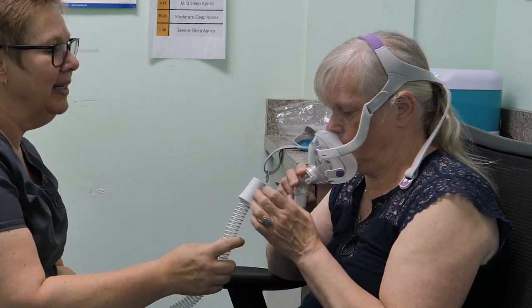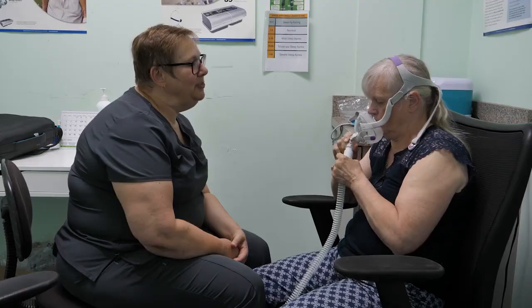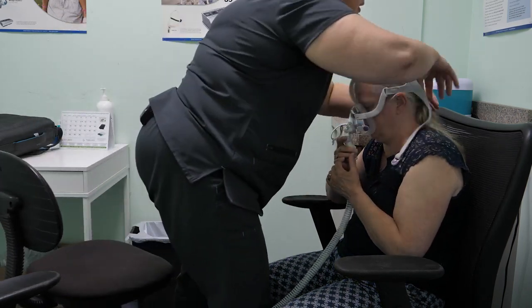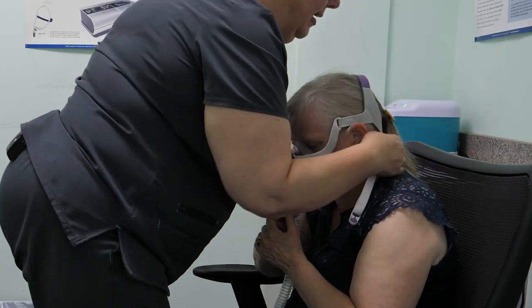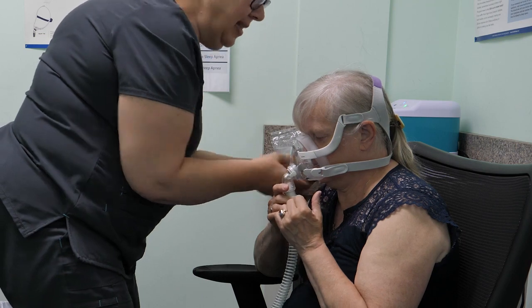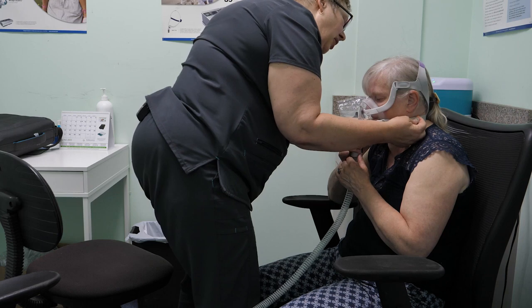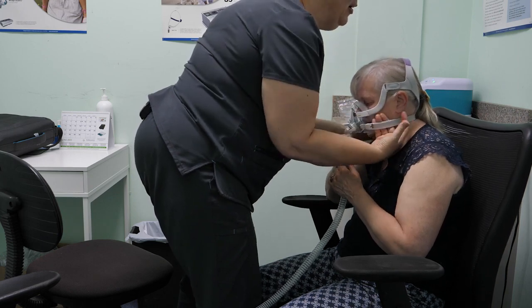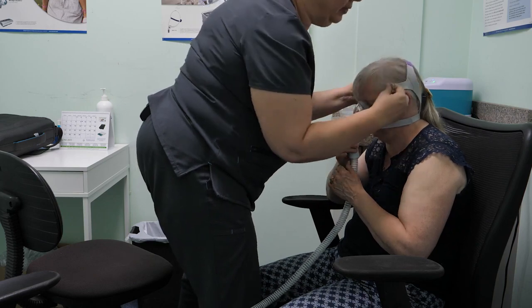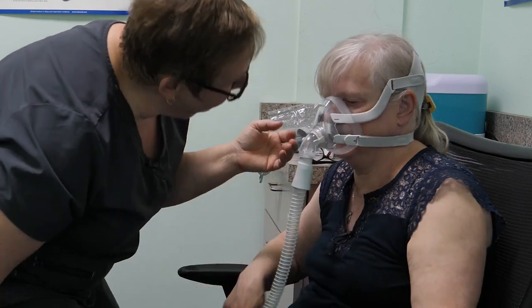Okay, so what you're going to do is you're going to hook this up to the bottom of your mask, just like that. Yeah, good job. And just put it on your face for a moment, and I'm going to help you with the headgear. So we're just going to put this under your ponytail again. So this is at the base of your neck. And the nice thing about this one is it's got a for her headgear, which is smaller, and we don't have to wrap it quite so tightly on you. How does that one feel? Way more comfortable. Way more comfortable?